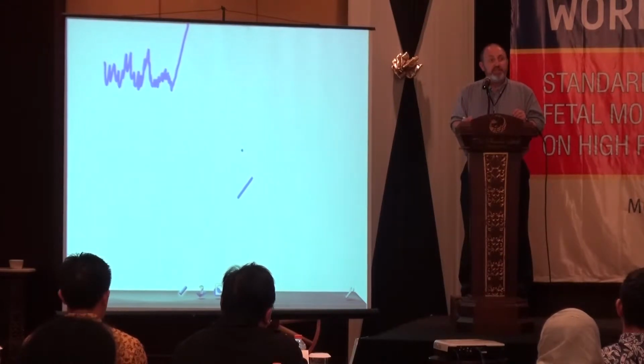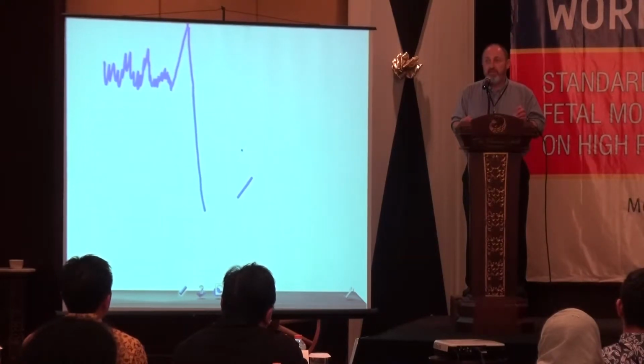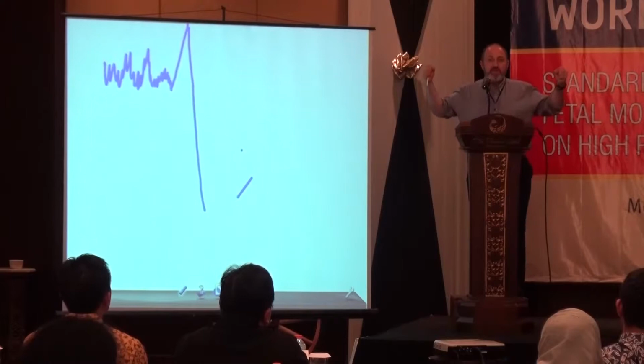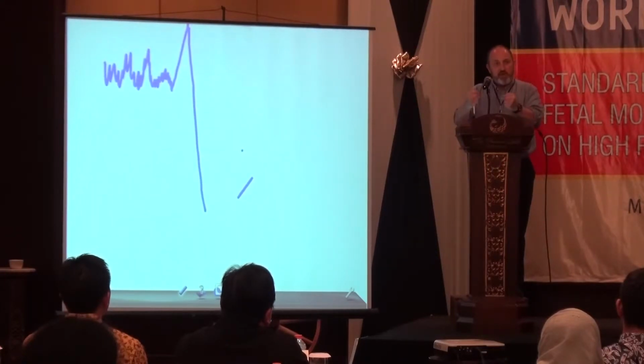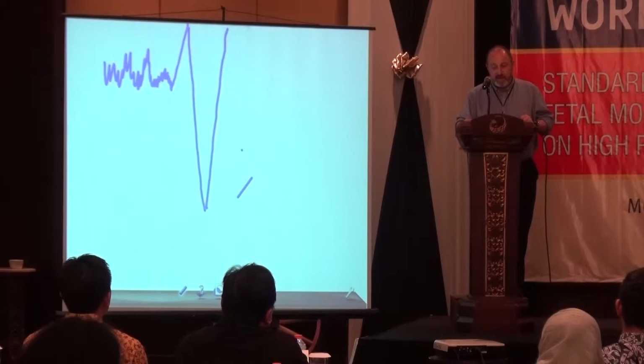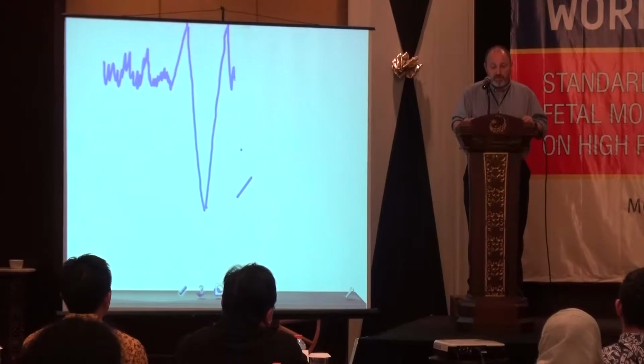As the contraction continues, what becomes occluded? The arteries, don't they? And that causes a temporary decrease in the baby's heart rate. As the contraction subsides, what opens? The arteries. So the pressure has come on, squeeze and close the vein, squeeze and close the arteries. As it's easing off now, the arteries are springing back open again. Baby's heart rate, due to a baroreceptor response, increases. And as the contraction eases off entirely, the vein will then open once the pressure drops below about 15 millimeters of mercury.